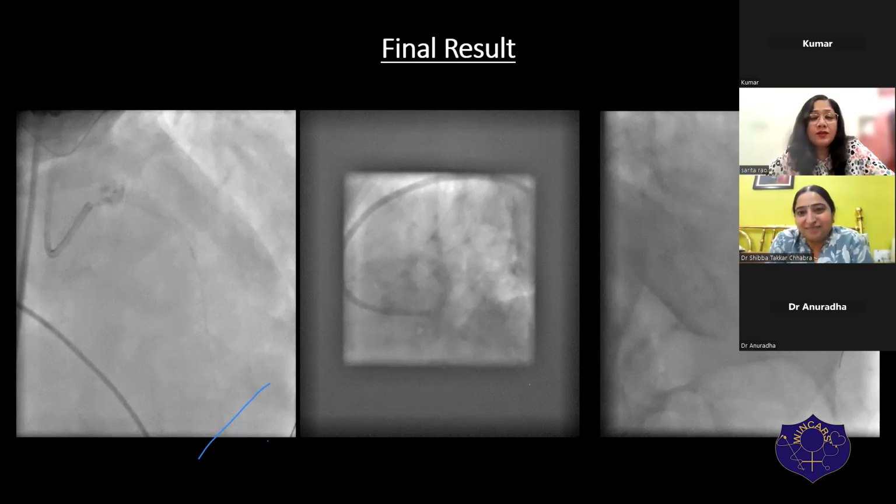Most importantly, when the patient is on dominant circ, I don't like to go left main to LAD. Contrary to the popular belief, most people like to stent from left main to LAD because technically that is much easier to do. I have a long series of patients whom I've stented from ostial LAD, and I've taken routine check shoots for them at 1 year, and they're doing really well.